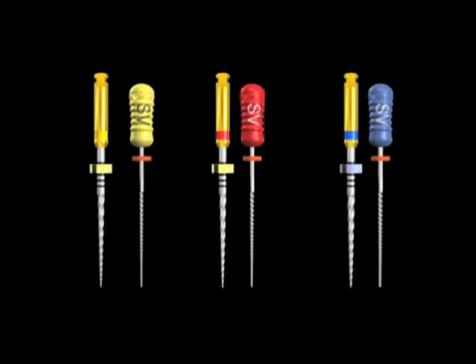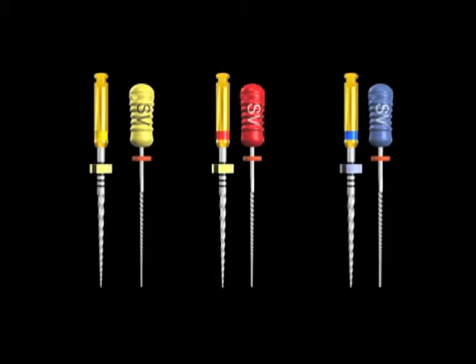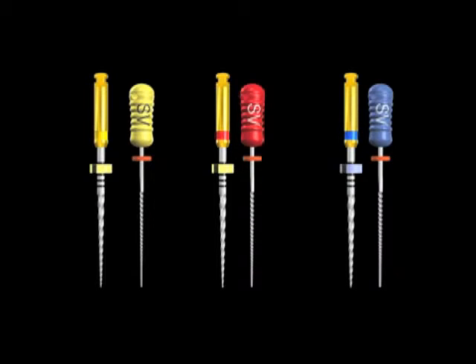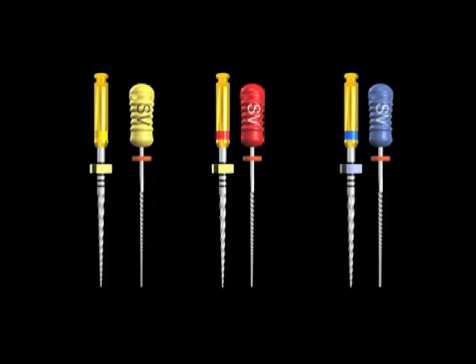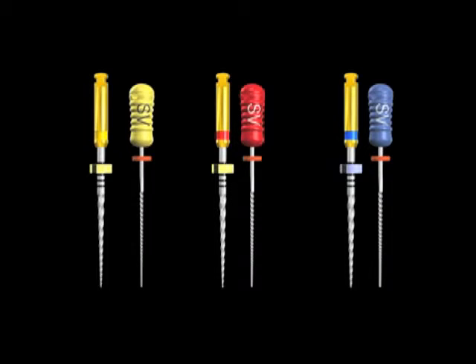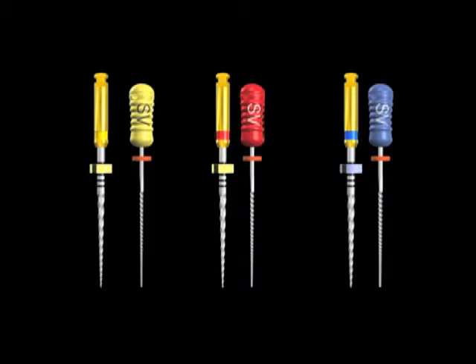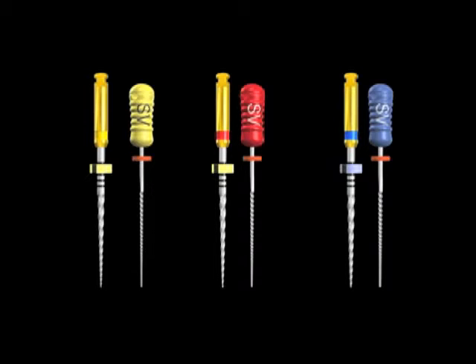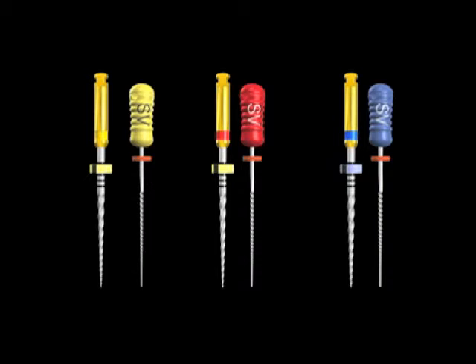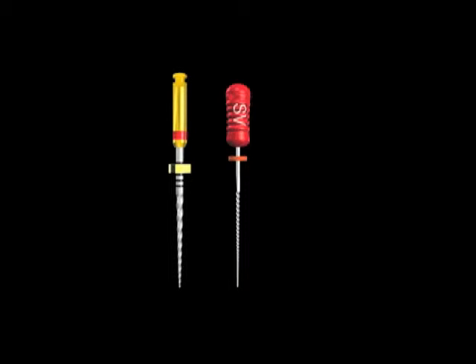Using your last shaping file to length, you select the GuttaCore carrier with the same terminal diameter. If the tip of your shaping file is a size 20, use a size 20 verifier, carry it to length, and it needs to be loose at length. If it's loose at length, that indicates which GuttaCore carrier size you'll actually select.